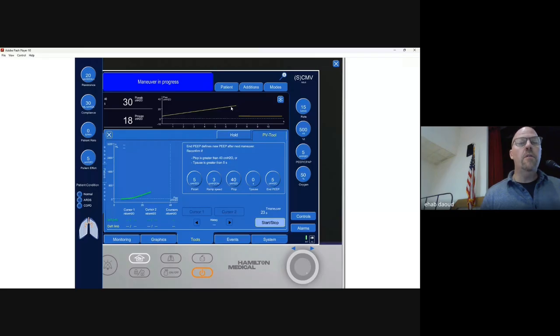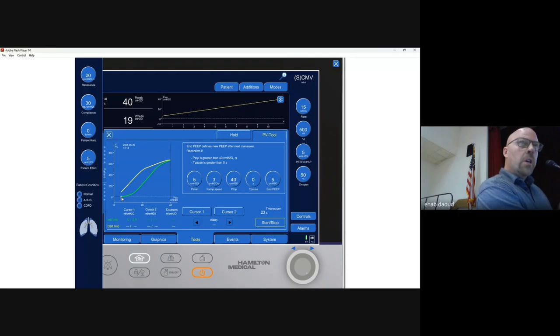So it's a nice slow flow breath. It's a single inflation. And what's going to happen is the curve here is going to populate and show us whether or not this patient can tolerate high PEEP or not. For reference points and without a slideshow behind me, the fatter this curve looks, the more of a football, like NFL football, pigskin, you guys know that. So the fatter this curve looks, the more highly recruitable this lung is, the more opportune or more beneficial higher PEEP recruitment maneuvers, and again, modes like APRV would be.